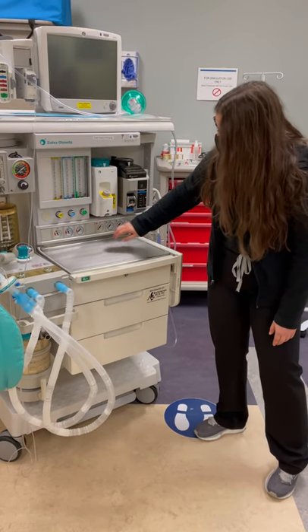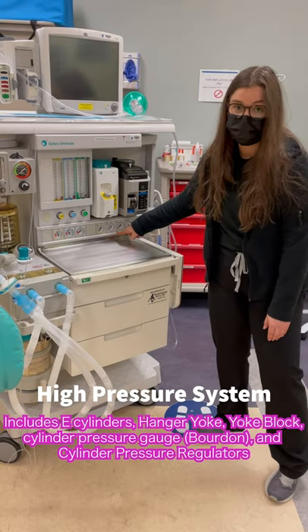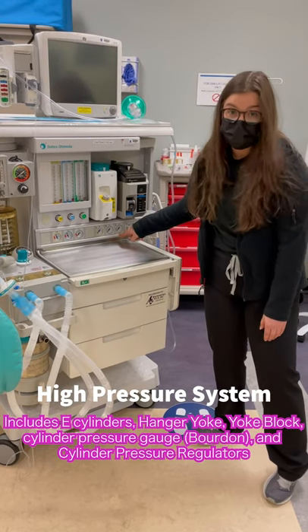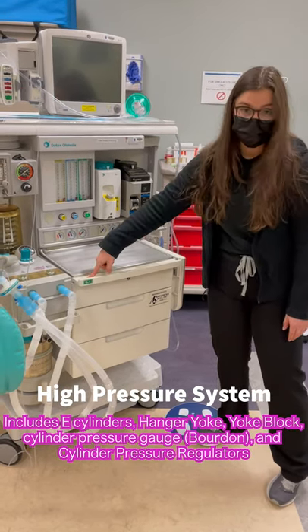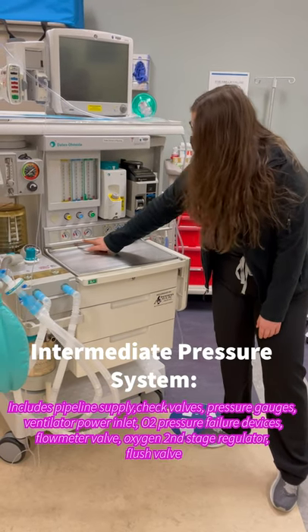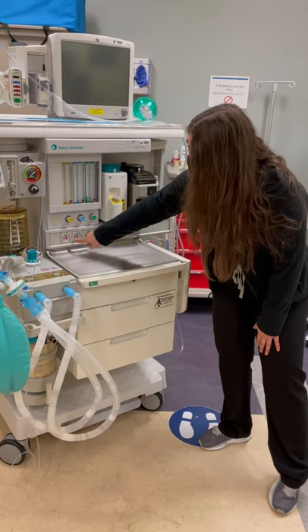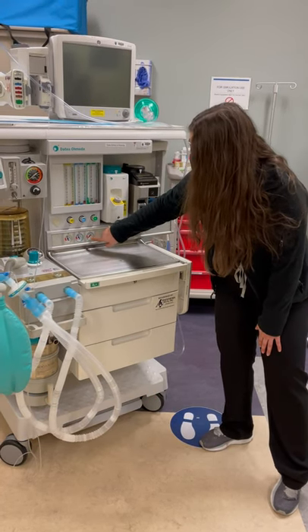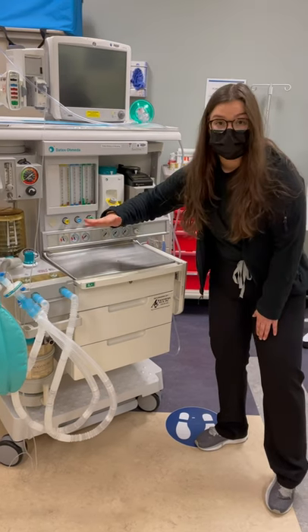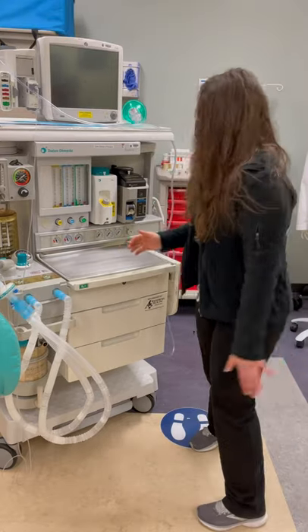These are my Bourdon gauges. These Bourdon gauges are for my high-pressure system or my E-cylinders. They're reading zero right now, which is perfect. If they didn't read zero, I would flush the system. These are my intermediate pressure Bourdon gauges. The pipeline supply is on right now, so they're reading between 40 and 50 over here. Usually they're zero if the pipeline supply is off. Right now they're on, so they need to be between 45 and 50 PSI.